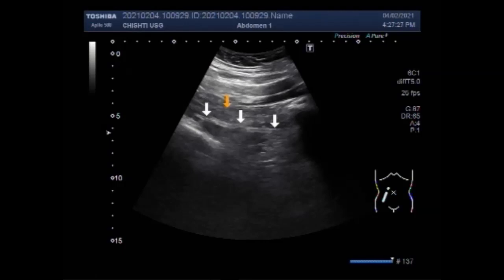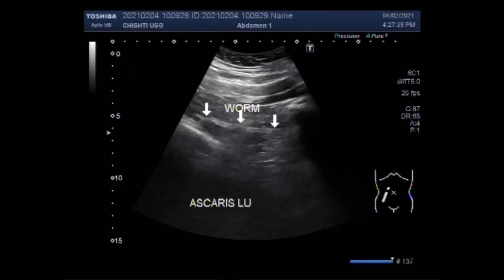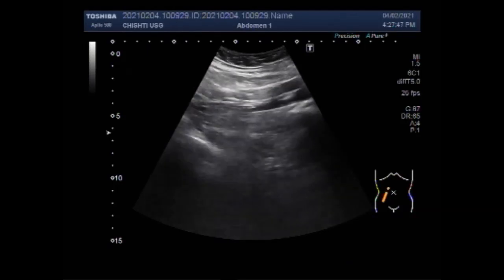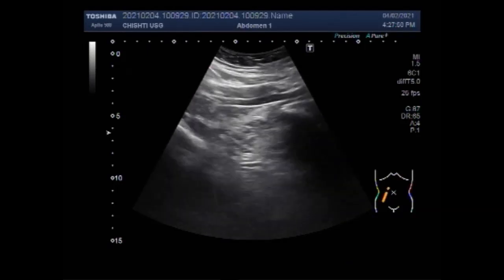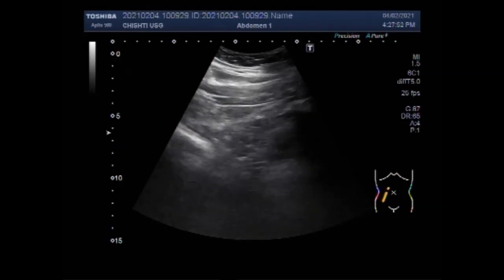Clinical manifestations vary according to the stage of the life cycle of the infection. You can see the Ascaris lumbricoides as a tubular structure, hypoechoic. The clinical manifestations relating to the gastrointestinal tract are due to the adult worm.